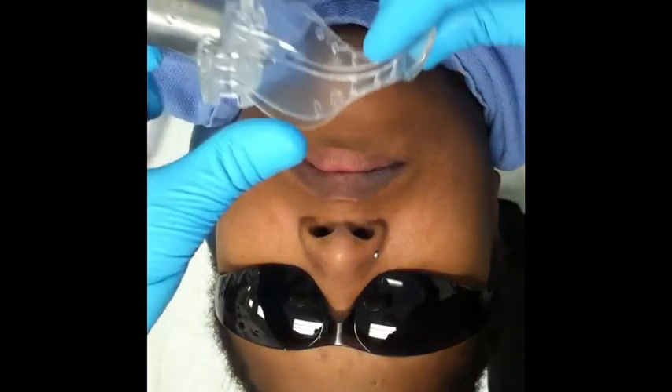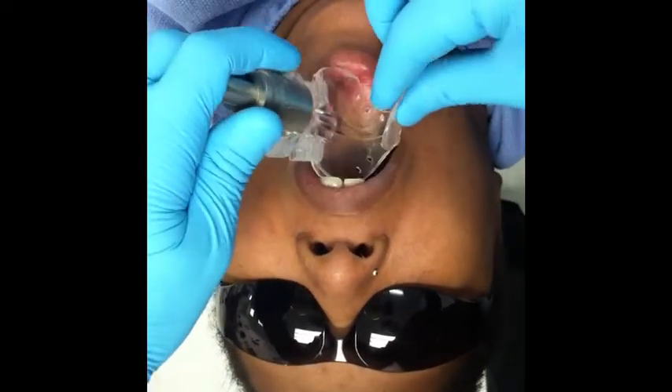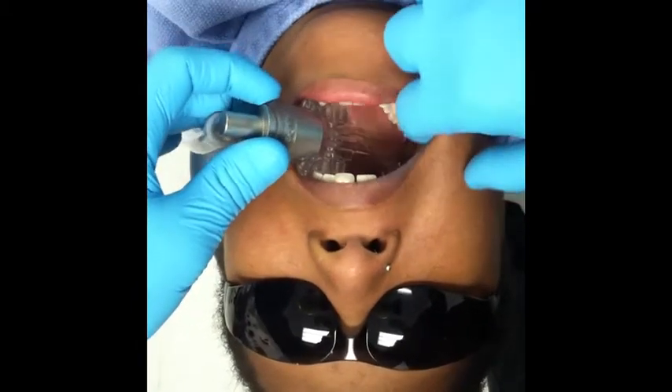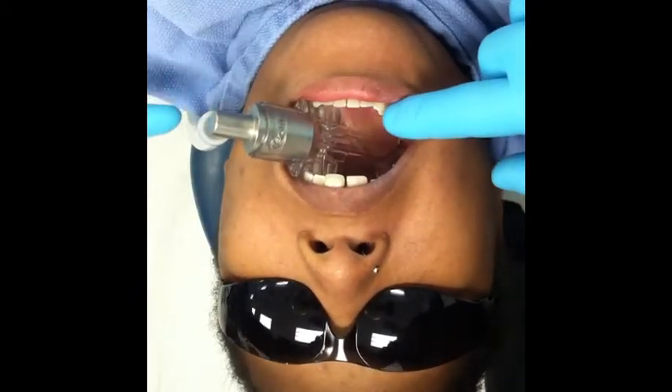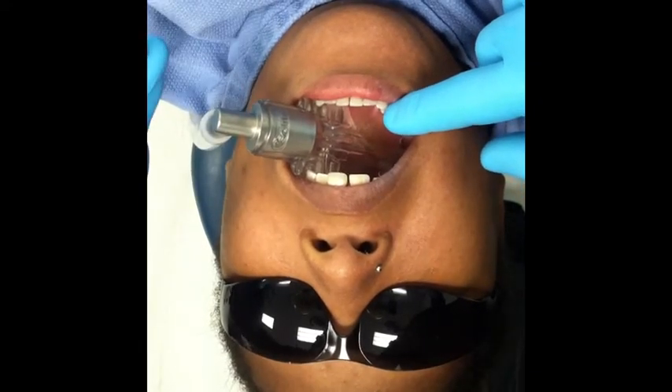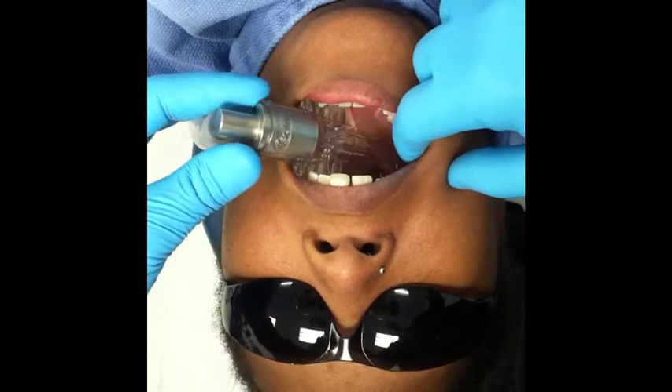This is the adapter with the tube kit attached. Bite down a little bit. So you can see how it hangs off the side — much better off the patient. And it feels a little bit lighter, easier to handle. Take that out.